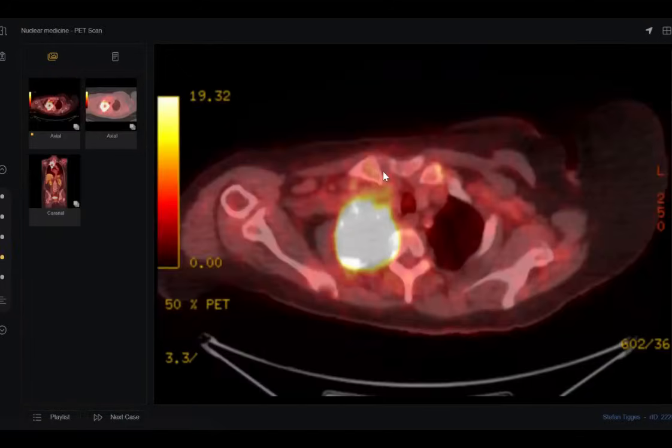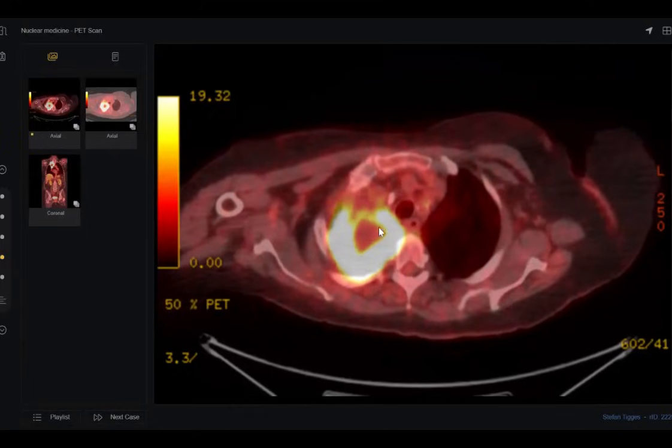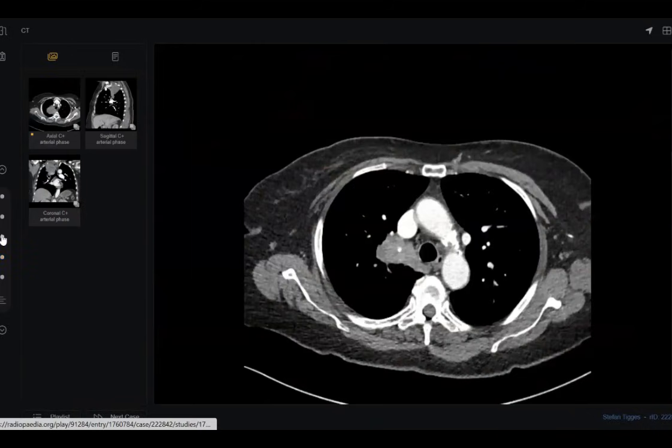See, to target the biopsy. Why? Because all of these have necrotic centers, but if you look at CT, you will not see necrosis here. So for most tumor biopsies, my colleague, it is better to take from the periphery as a general rule, because most of the centers are necrotic.